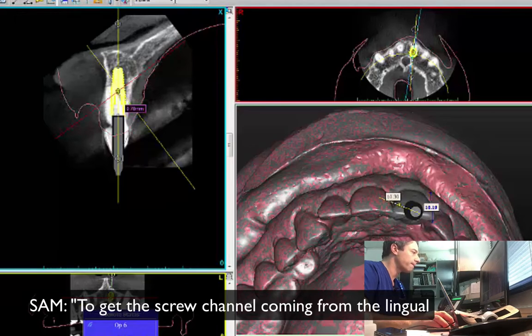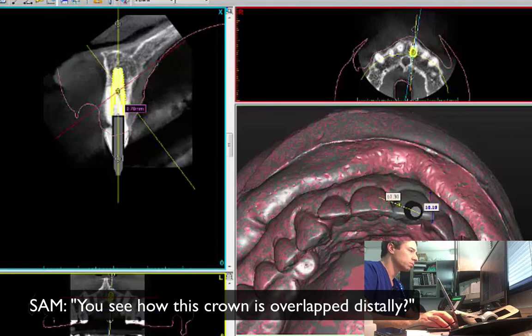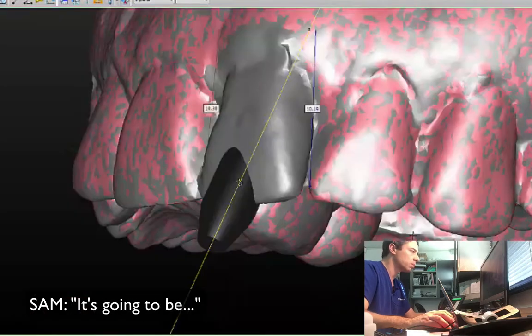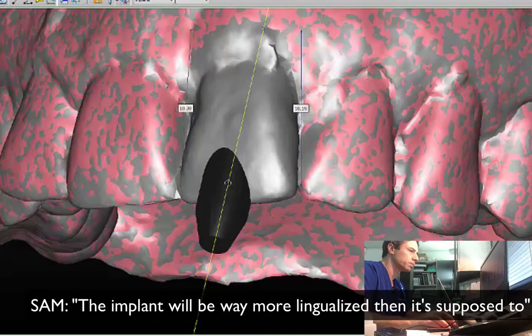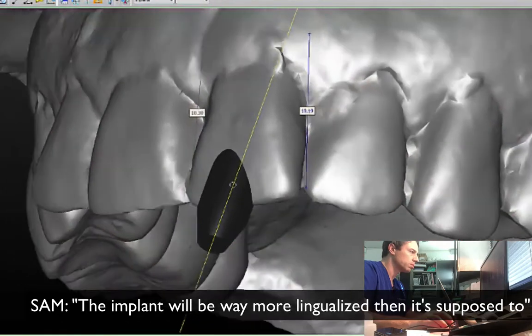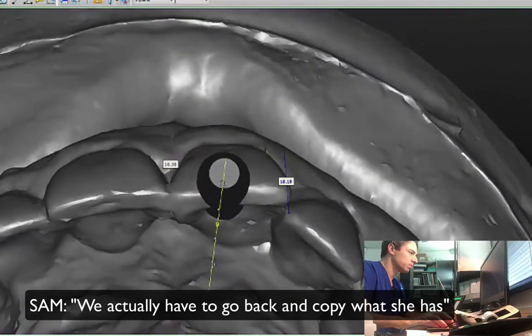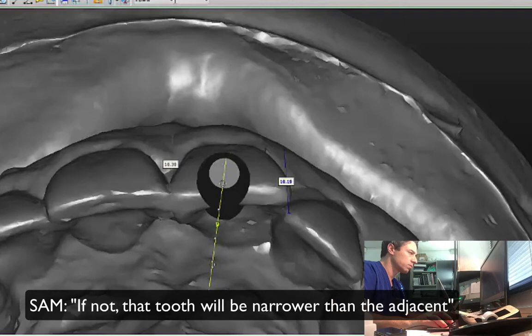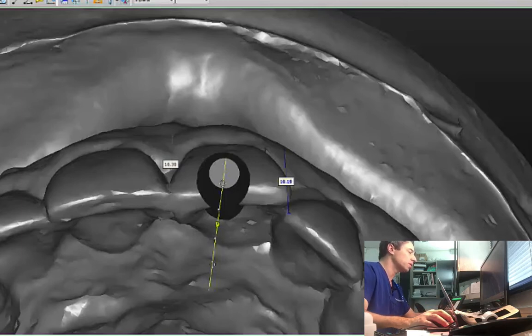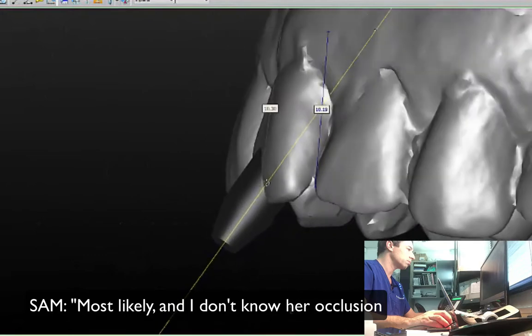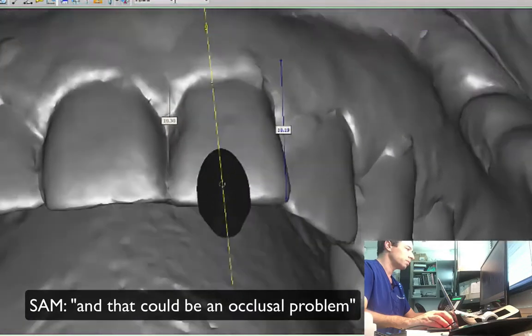Because remember — you see how this crown is overlapped distally? Yes. So when you bring it more lingual, the implant will be way more lingualized than it's supposed to. We have to make a smaller tooth to fit in the space. We actually have to go back and copy what she has. If not, that tooth will be narrower than the adjacent. So basically what we're thinking — we're going to give this patient the same what she had before. Right. So it's still going to be an overlapping crown.